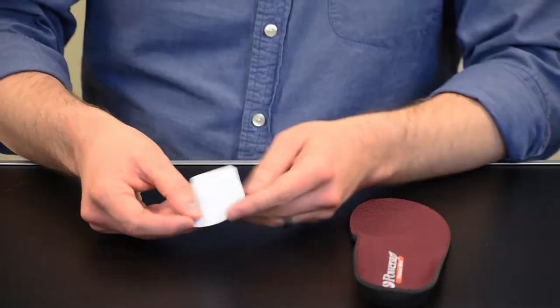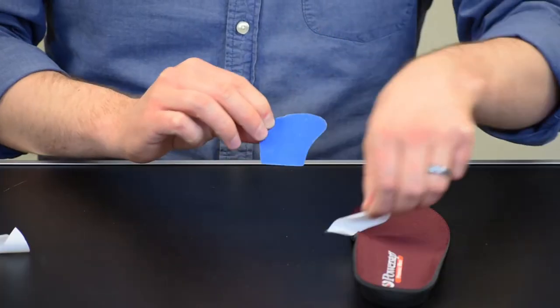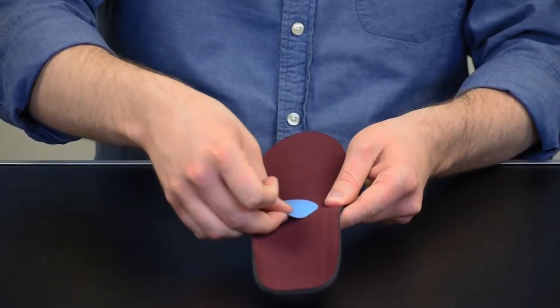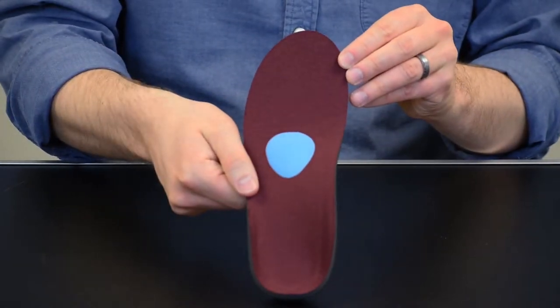To apply, select left or right if designated, and remove the adhesive backing from the cushion. Apply firmly to the top of the orthotic with the support just behind the metatarsal heads — this will help spread them and relieve unnecessary pressure. Adjust the position as necessary for comfort.